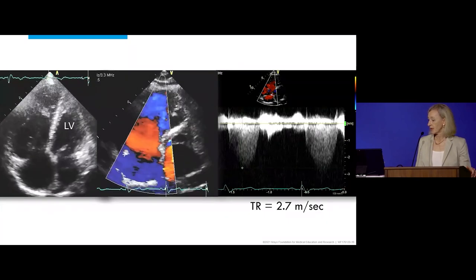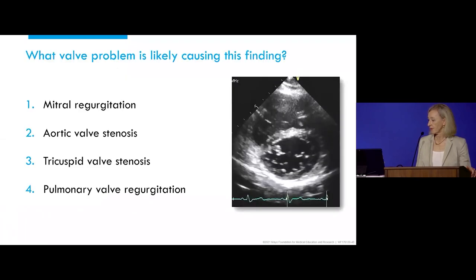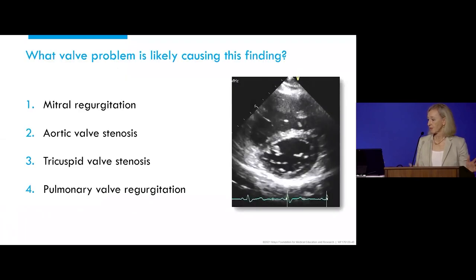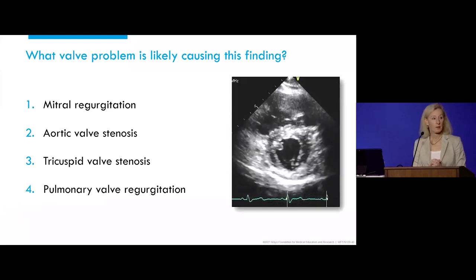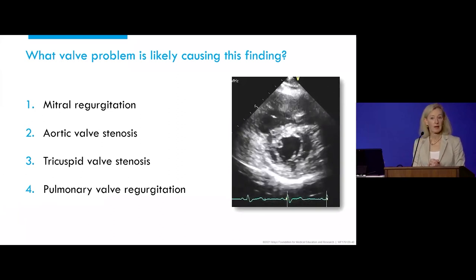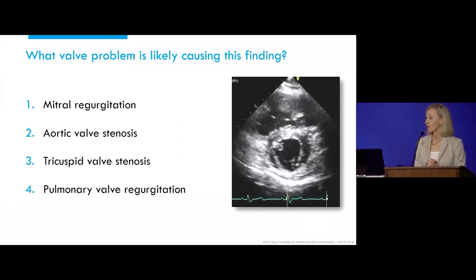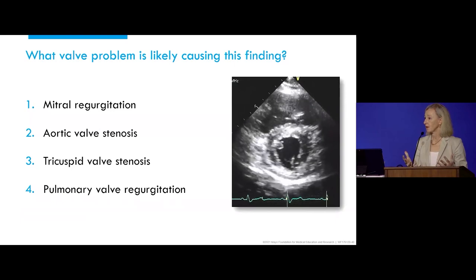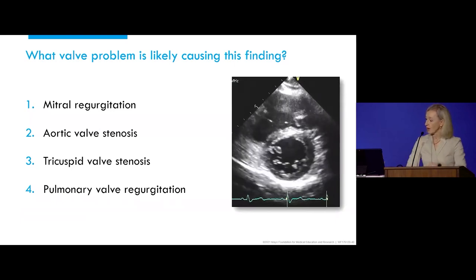TR velocity 2.7. The first question: what valve problem is likely causing the finding that you see on this parasternal short axis view?